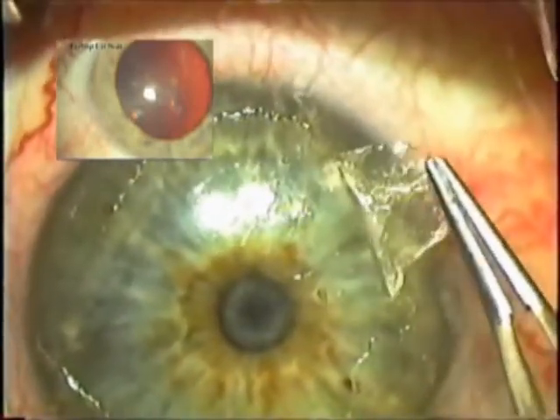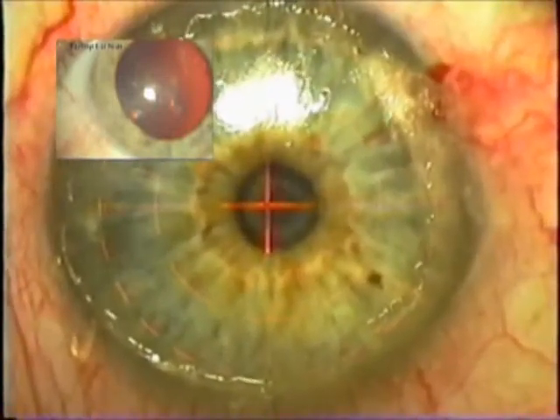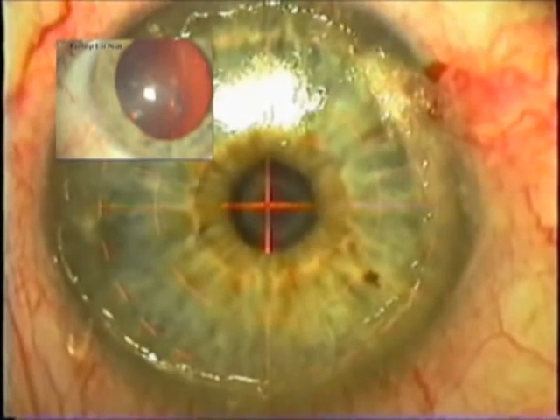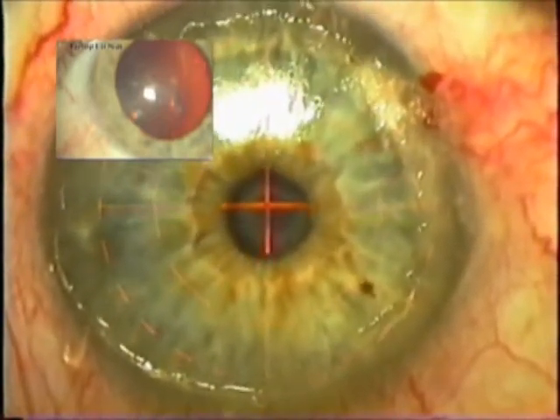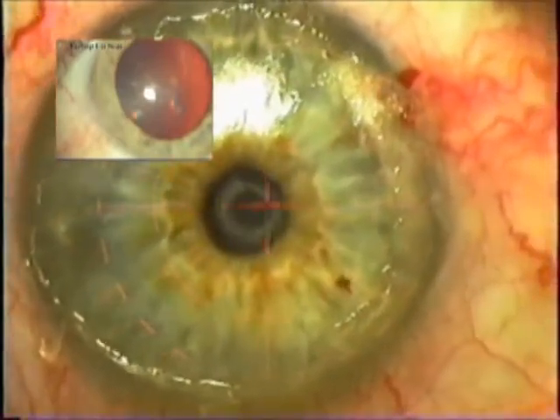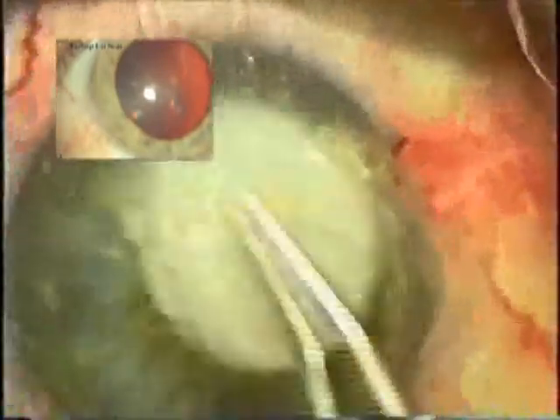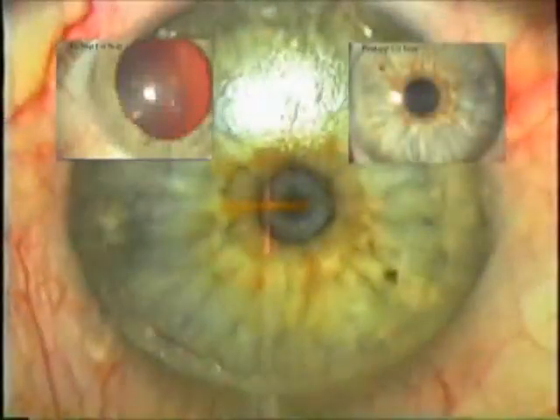Once the scar has cleared the visual axis, the excimer laser photoablation can continue. This is followed by a Mitomycin C application, once again resulting in a clear visual axis with an excellent refractive outcome.